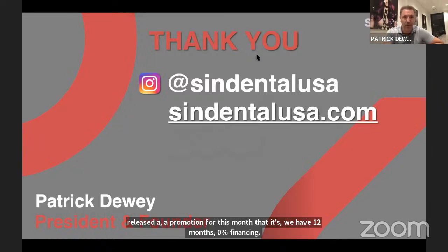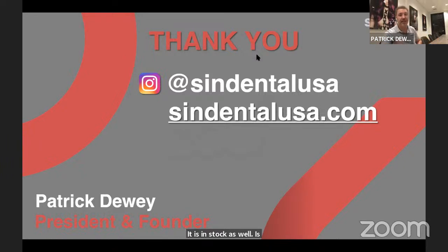Is Formlabs Print able to print the temp prosthesis? Yes, Formlabs is. Now, it's not necessarily the printer that's important. It is for us because we know we need to do it in 20 minutes, but what's key is the resin. So what I highly recommend is using SprintRay's resin if you can get the parameter set with XYZ axis in the Formlabs printer. That's the most important step. The key is to make sure that it's cured properly and it doesn't compromise the strength.